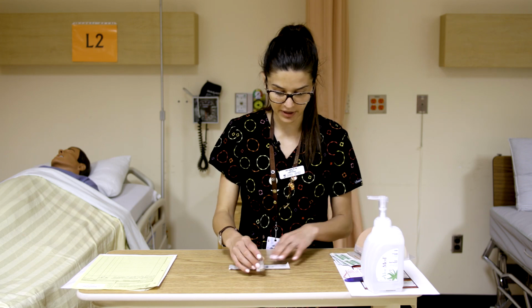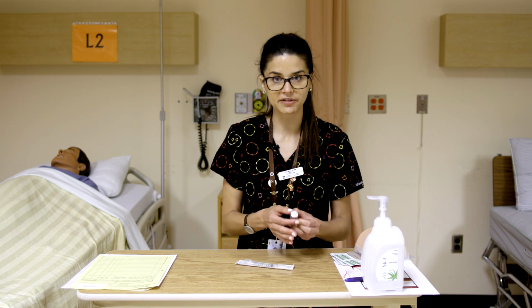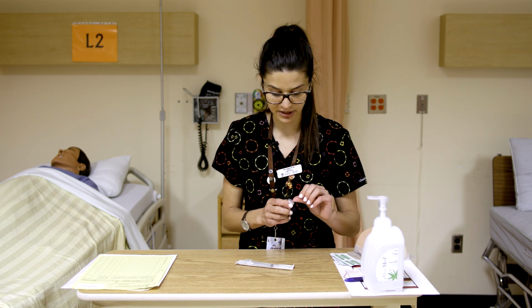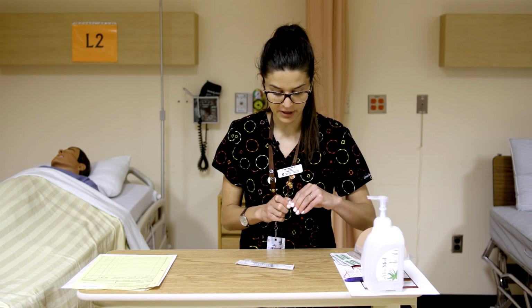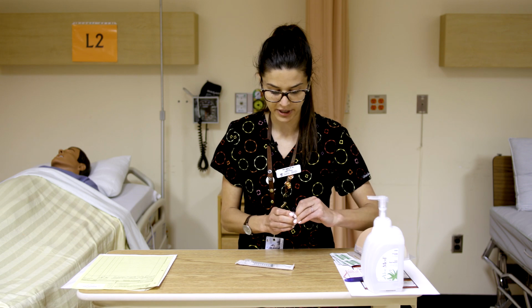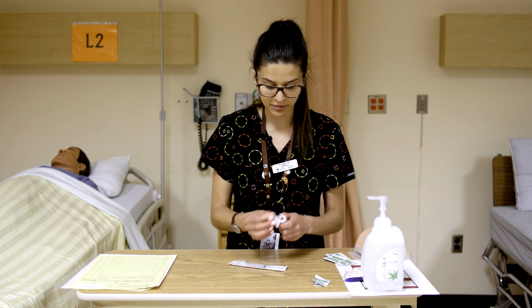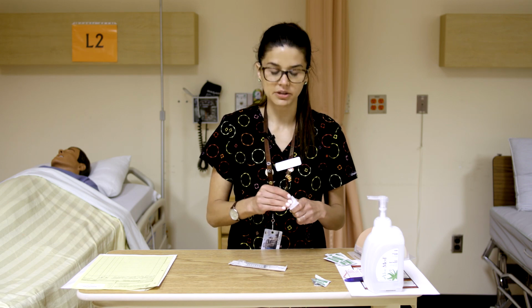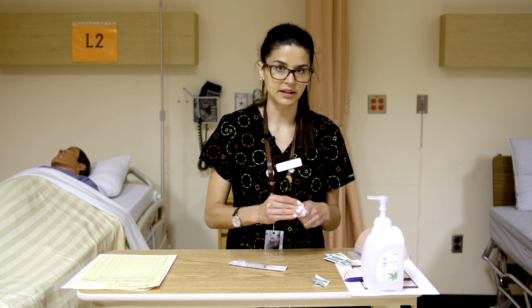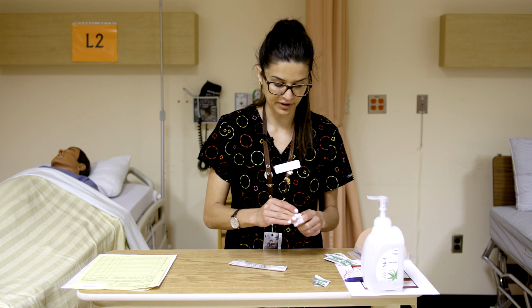So we're going to prepare our medication now. We're going to crack the top off of this vial. It's a little bit different than the one you've seen before, but you will see all different types. So this one actually has a metal sort of covering on it, which you can lift up and break off. It can be easily peeled off. Again, we'll want to clean that really thoroughly, doing a circular motion, applying pressure, and we're going to do that for 30 seconds and let it dry before we get into that vial with our needle.